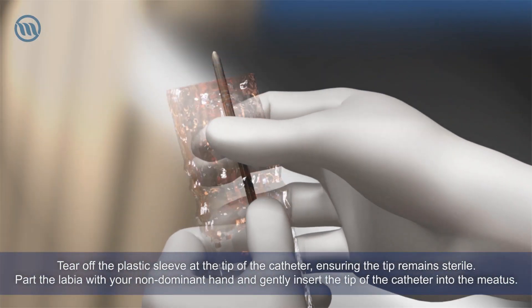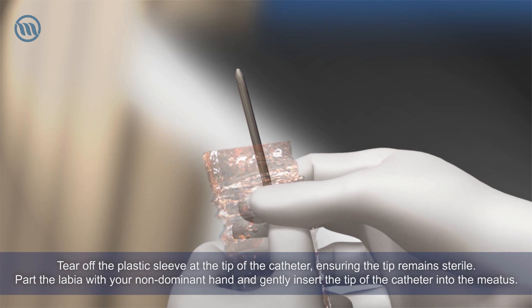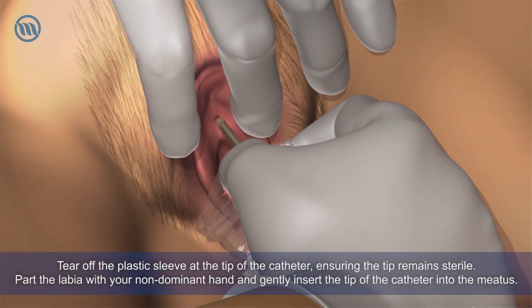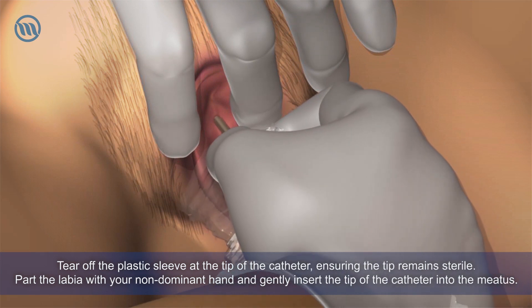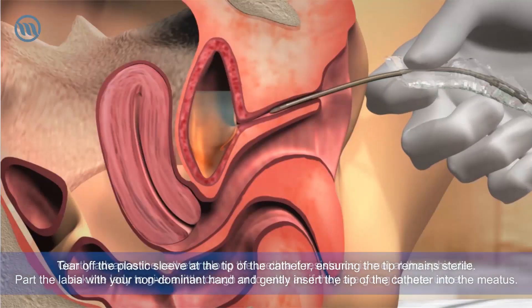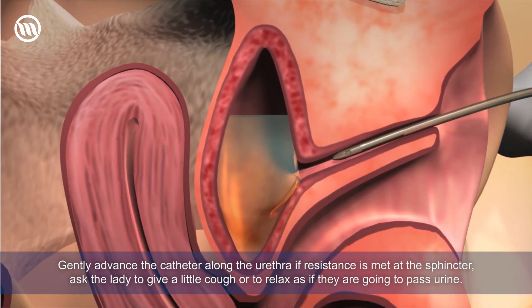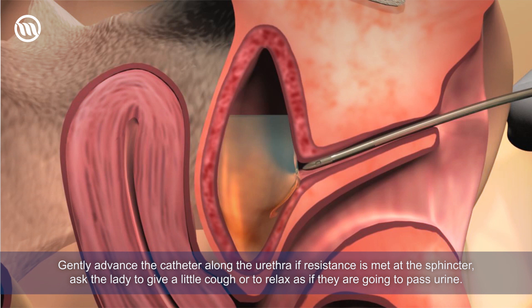Tear off the plastic sleeve at the tip of the catheter, ensuring the tip remains sterile. Part the labia with your non-dominant hand and gently insert the tip of the catheter into the meatus. Gently advance the catheter along the urethra. If resistance is met at the sphincter, ask the patient to give a little cough or to relax as if they are going to pass urine.